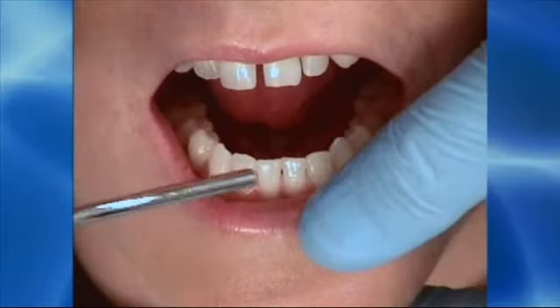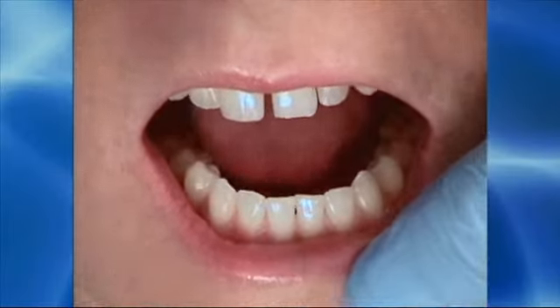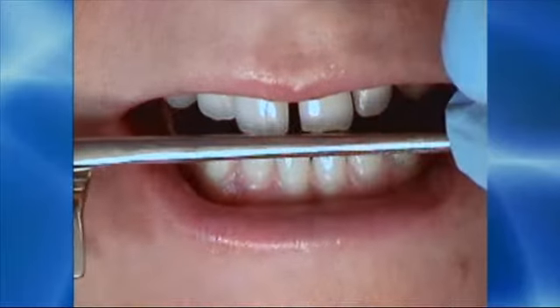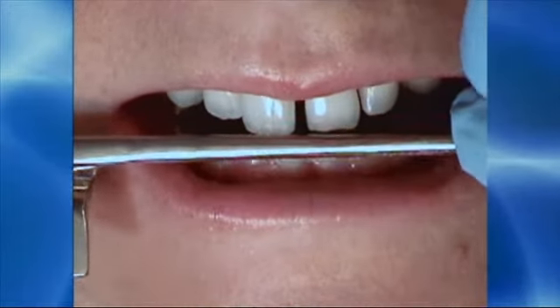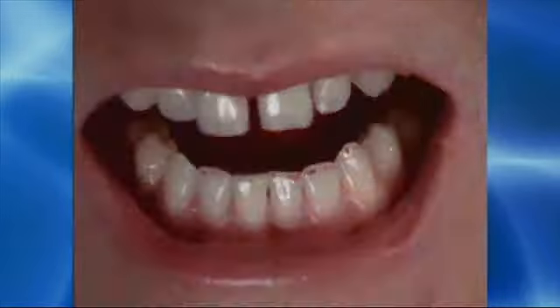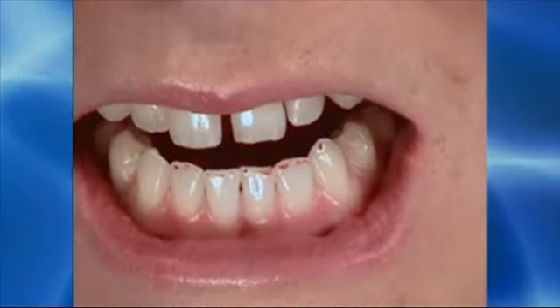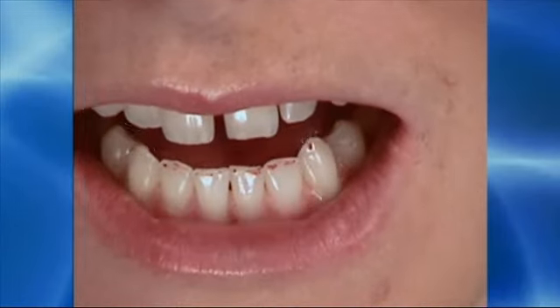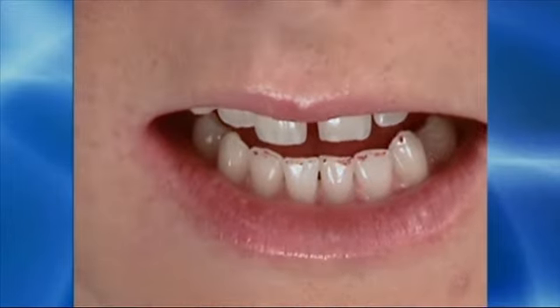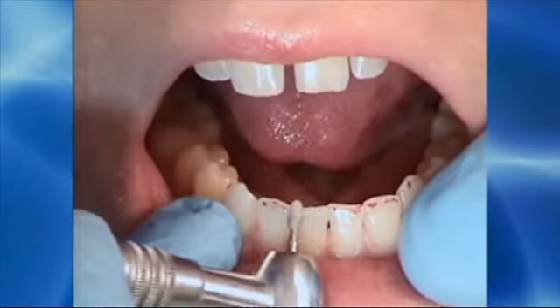So I will dry the teeth again, but this time have the patient self-intercuspate without sliding in any direction in order to mark the lower anterior teeth and the upper anterior teeth where there is too much anterior pressure. The contacts that create the pressure are generally down on the facial aspect of the incisal edge, and you can see all the series of marks that make up this excessive anterior pressure.